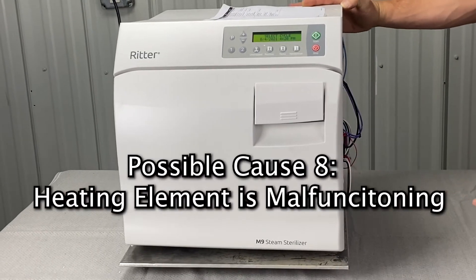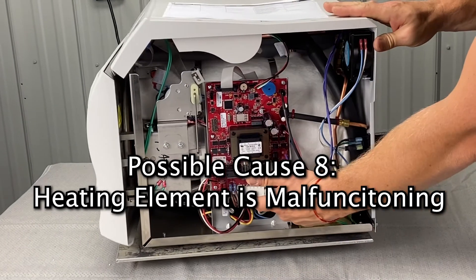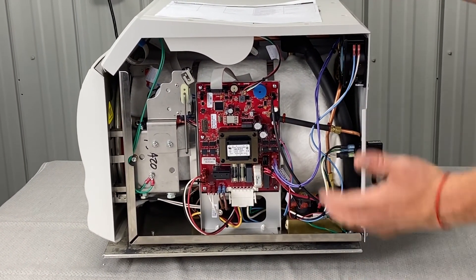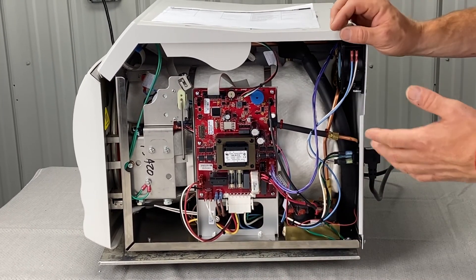It could be that your heating element is going bad. We can do a resistance test — unplug the power and use a multimeter to test the heating element resistance and make sure that's good.